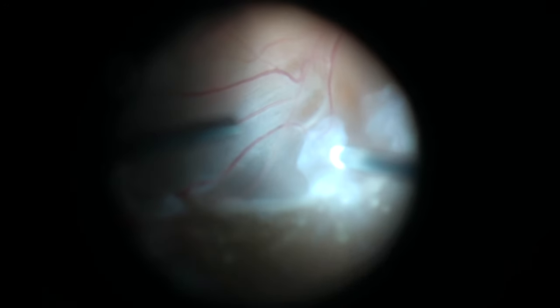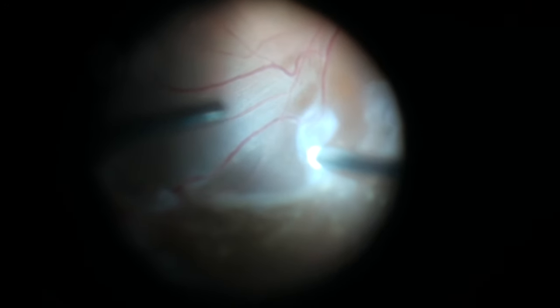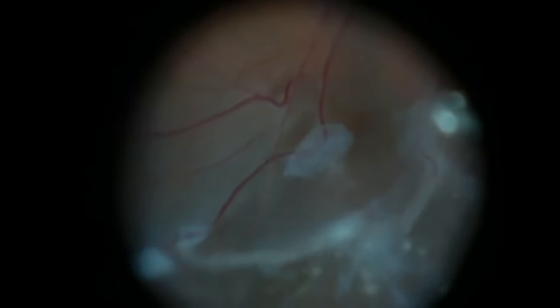Once all these areas are free, I've trimmed some of the peripheral vitreous off and then add laser. I put air in the eye first, then laser, and then ultimately I did put gas in this patient's eye.